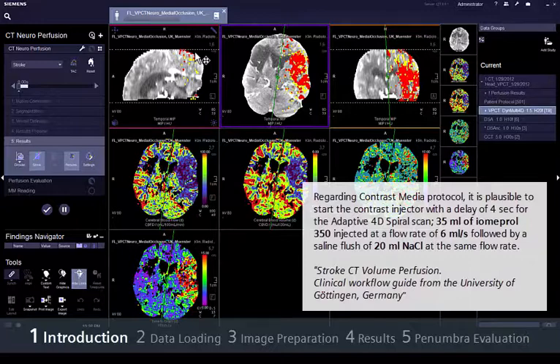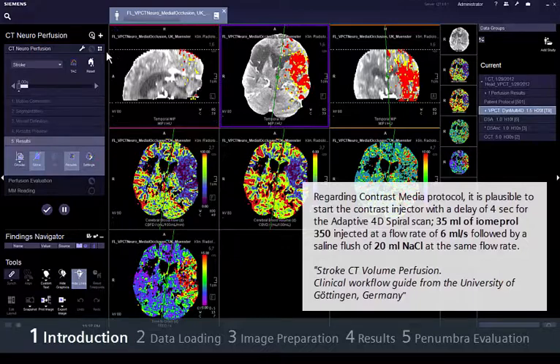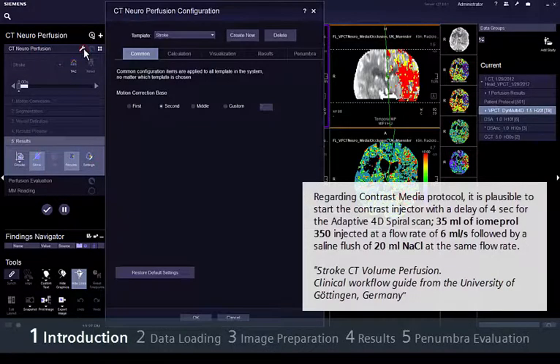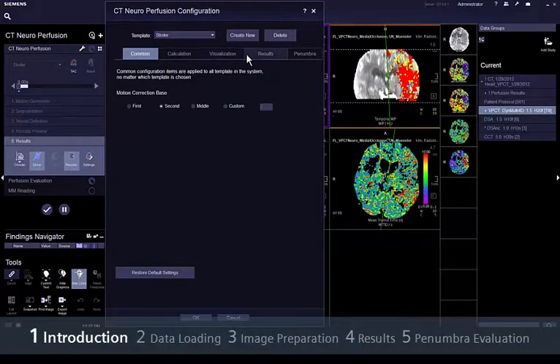35 ml of iomeprol 350 injected at a flow rate of 6 ml per second, followed by a saline flush of 20 ml NaCl at the same flow rate.